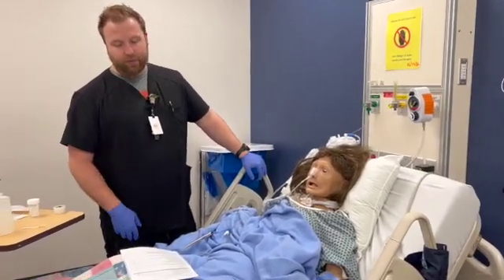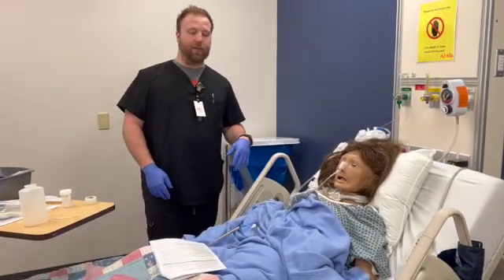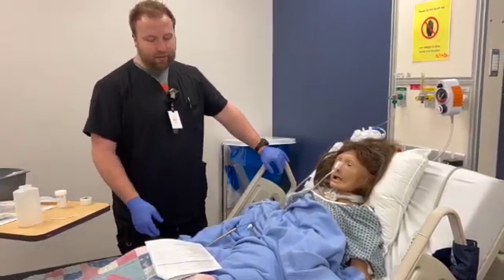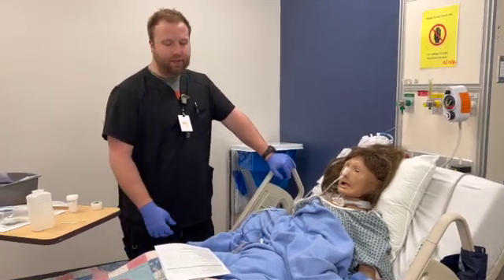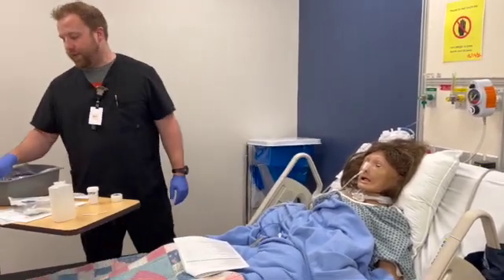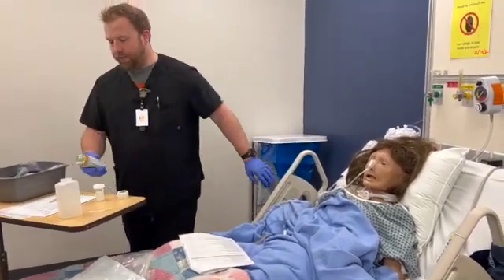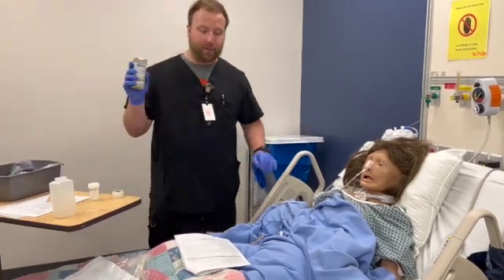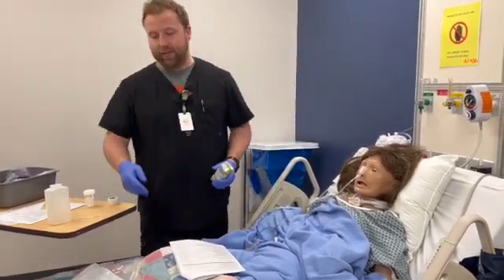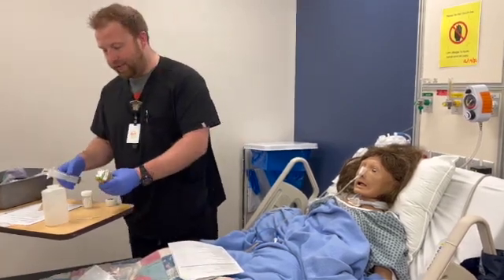Now we'll move on to tube feedings. We'll again start over, like we're walking in the room all over again, doing our K-wipes, double identifying our patient, confirming our orders. We will have our orders. Says to give Nutrin 1.0 with fiber, 240 mLs. We have a box of 250. The best way to do this is I will just take 10 out and I only have 240 left in here.